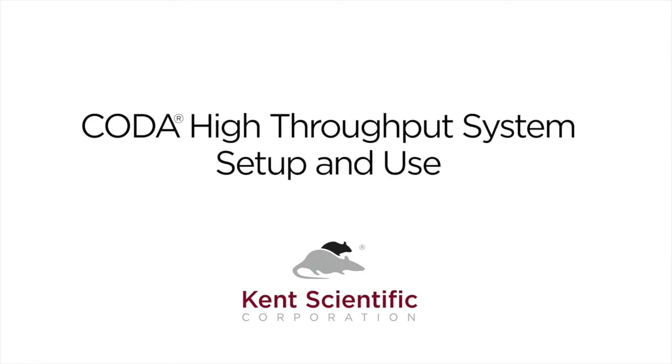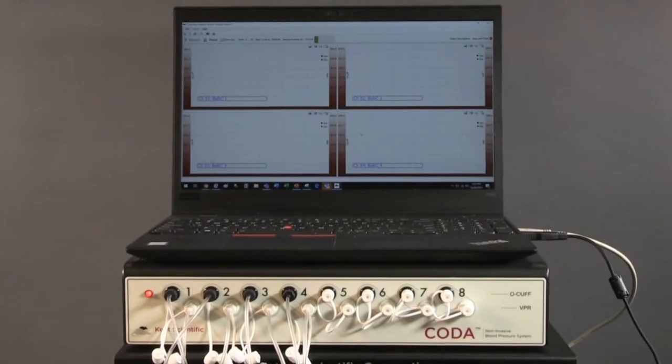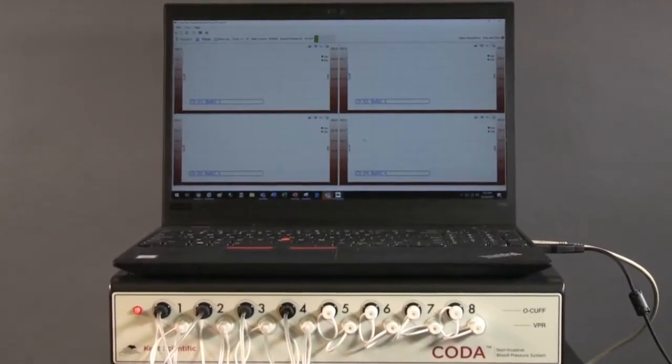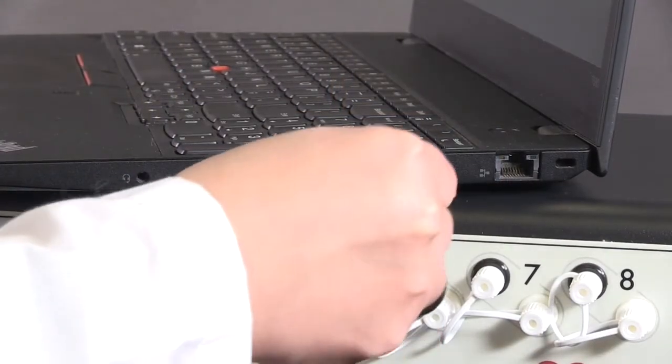The CODA high throughput systems include an easy-to-use software interface. To set up your CODA system, install the software onto your computer or laptop. Connect the CODA controller to the computer using the included USB cable.